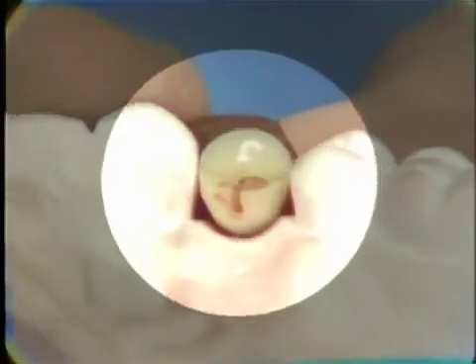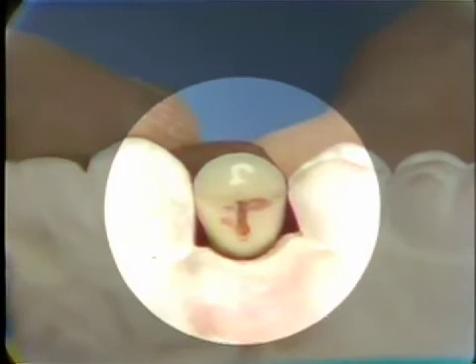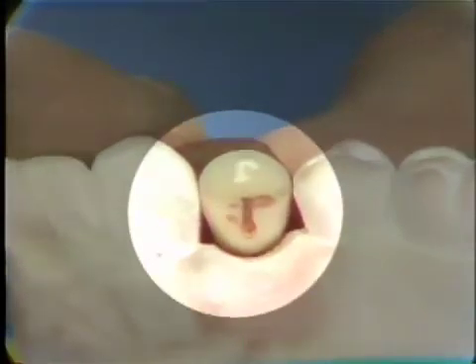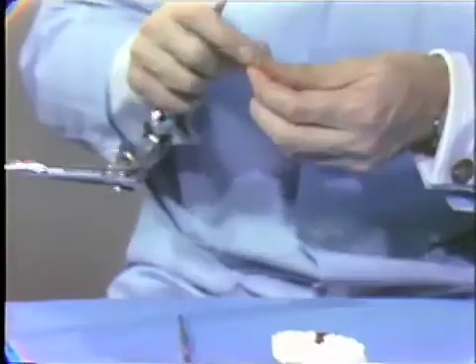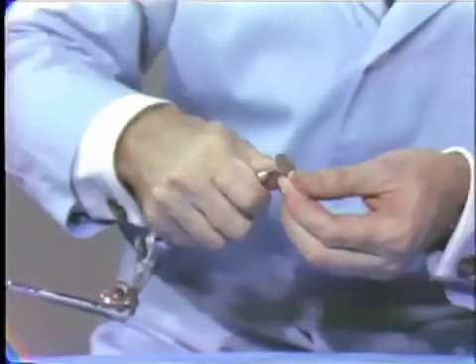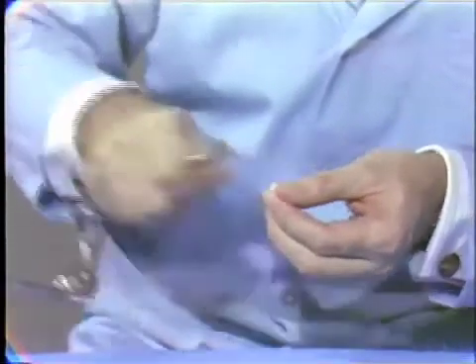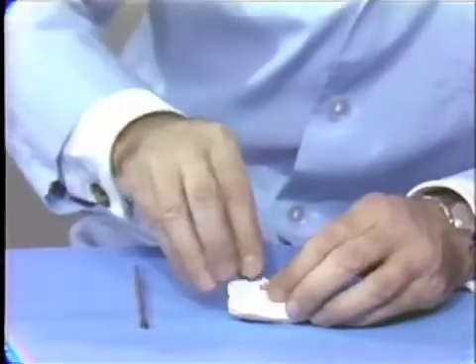Create a little more space on the distal. It's just a little bit closed up in there. The embrasure is not opened on the lingual as much as it should. So I'm going to go back to that spot there and just grind a little more off in relation to the bicuspid. And we'll pop that back again and see whether we've done what we want to do.